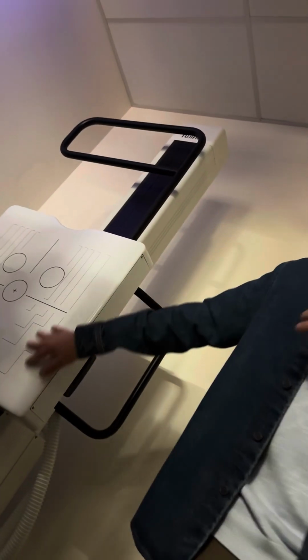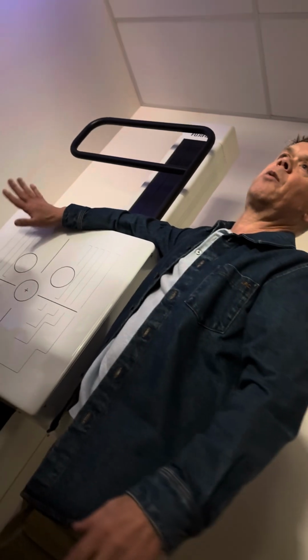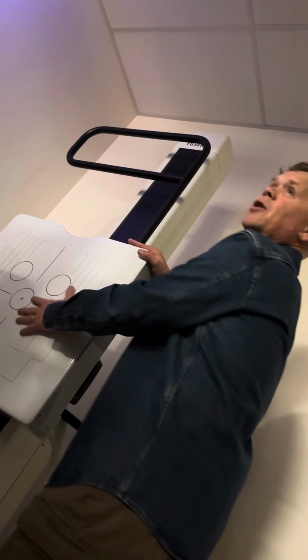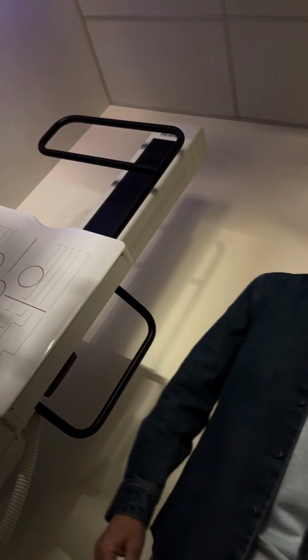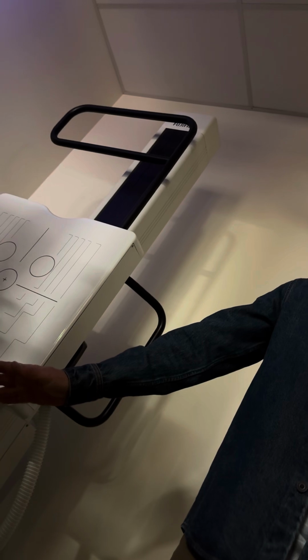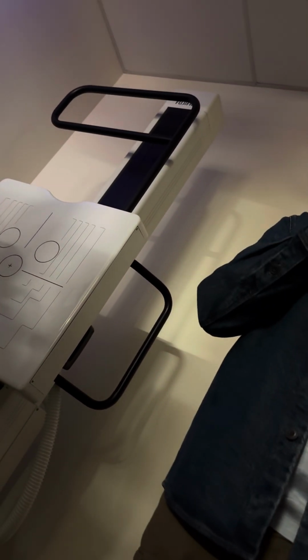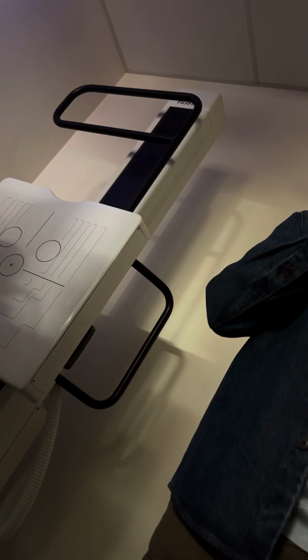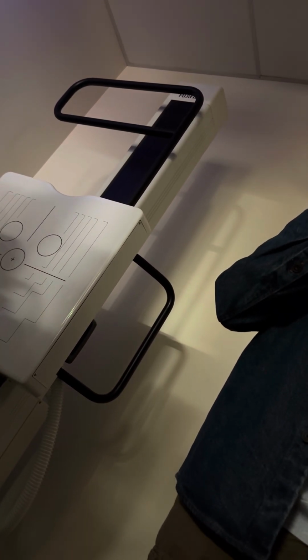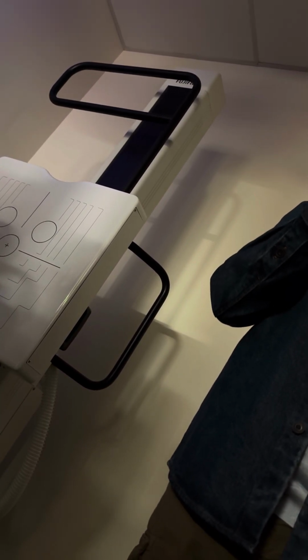If you want to do nasal bones, I think you're going to find it easiest, even though Yodi was really wonderful in terms of the way she helped me with it, to tape it onto the image receptor. Questions? How many views is it for the facial? For facial bones, it's all the same, except for now what we've added is the nasal bone and the Waters. So you just added a nasal bone, Waters, and the lateral.